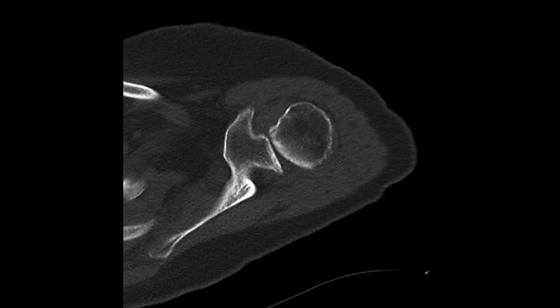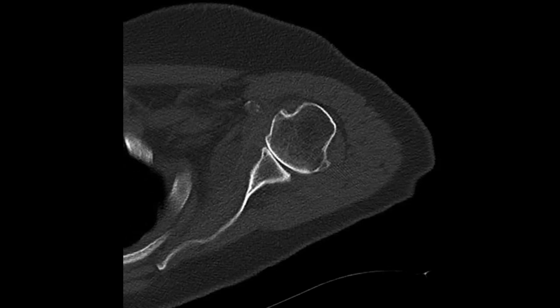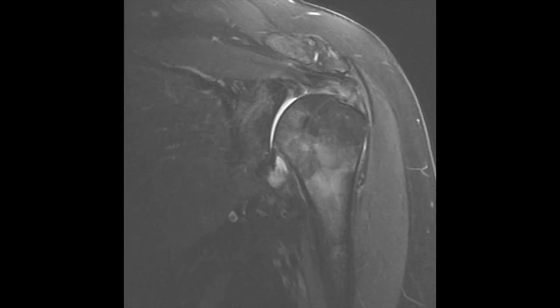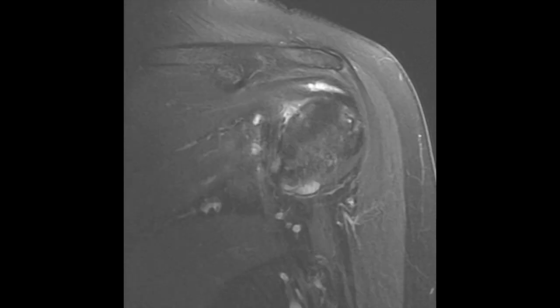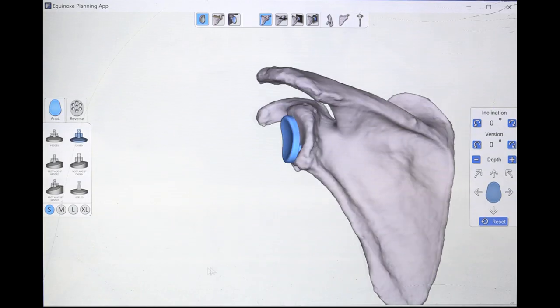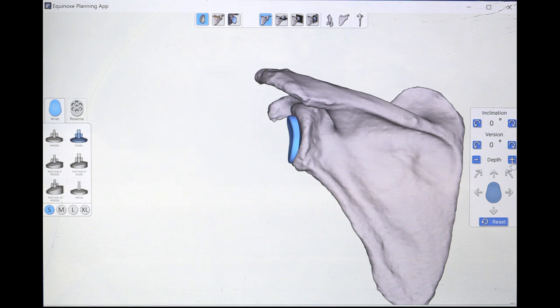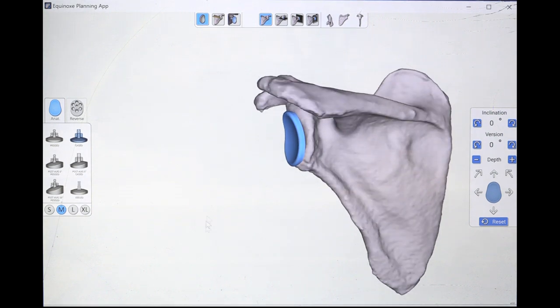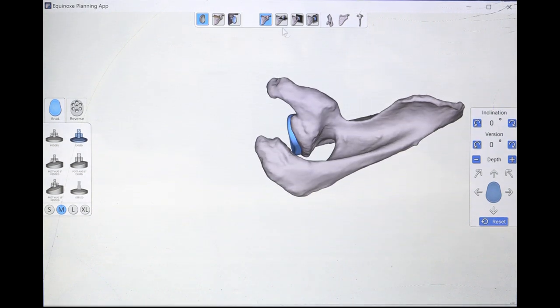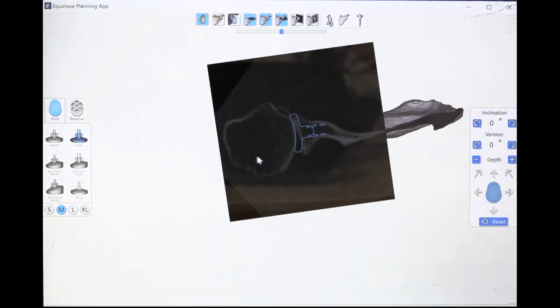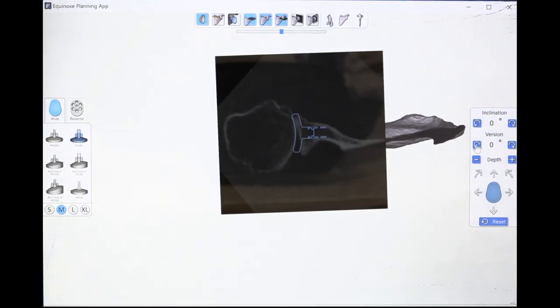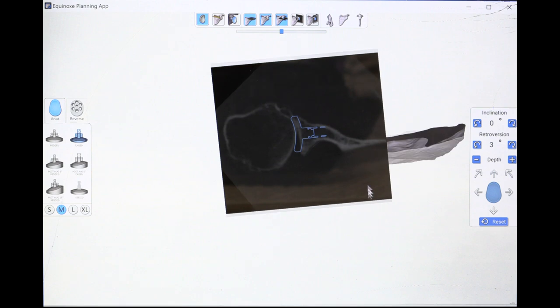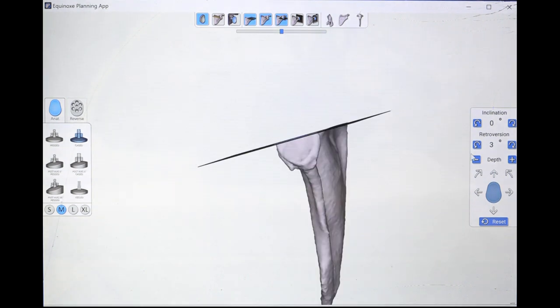CT scan confirms the glenoid anatomy with the absence of significant asymmetric erosion. In this patient, an MRI was also available which showed an intact rotator cuff. Preoperative planning was performed using GPS software. We determined that we would utilize a medium-sized glenoid component, placing the component in approximately 3 degrees of retroversion with 0 degrees inclination, providing the optimal position with minimal bone removal.